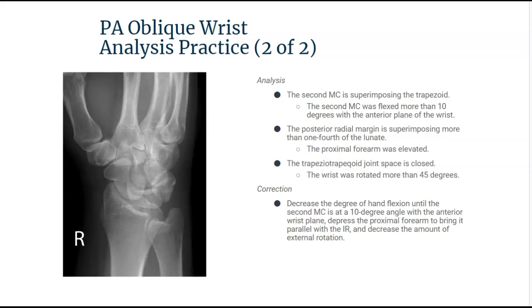In our second practice analysis, you can see that the metacarpals are once again superimposing each other. Looking at the trapezium, the relationship of the trapezium and trapezoid — their joint spaces are closed. We hardly even see the trapezoid and the capitate relationship. Everything is in external rotation; we are at more than 45 degrees in our obliquity.